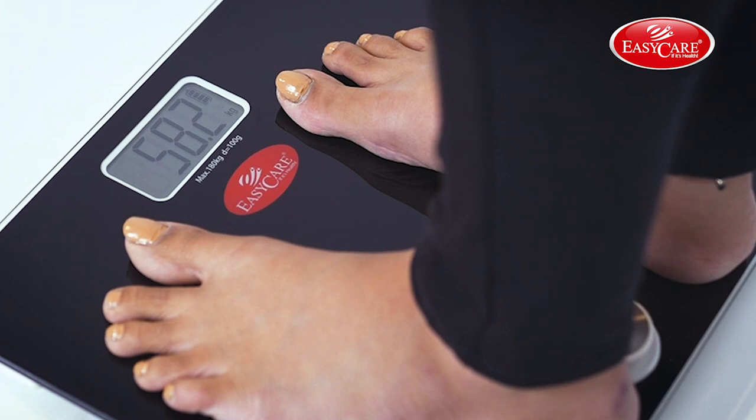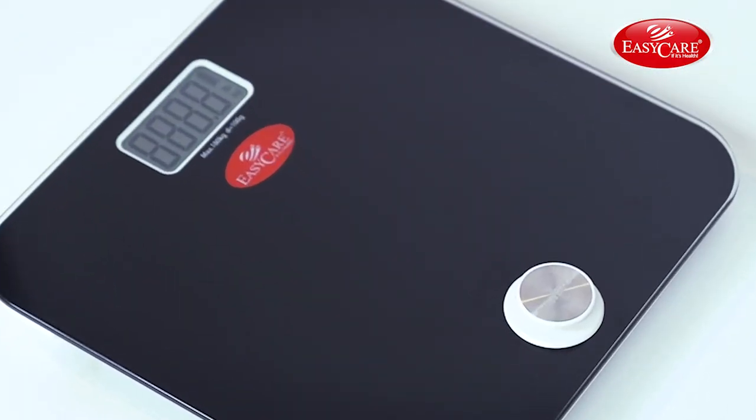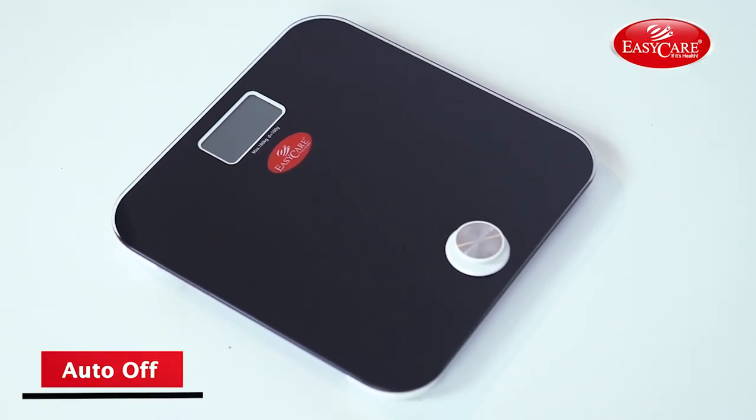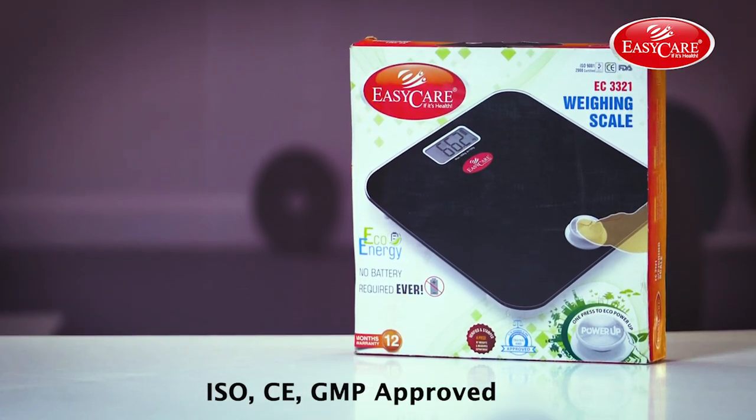After the weight measurement, just step off the scale. The LCD display would return to zero and the scale would auto shut off in a while. Keep track of your weight with EZ Care's battery-free weighing machine.